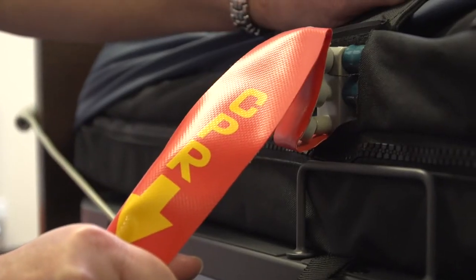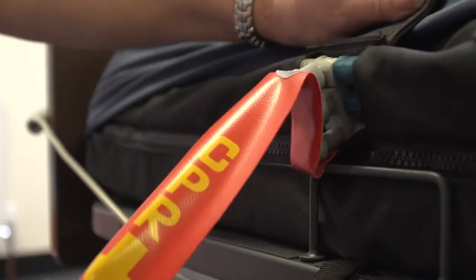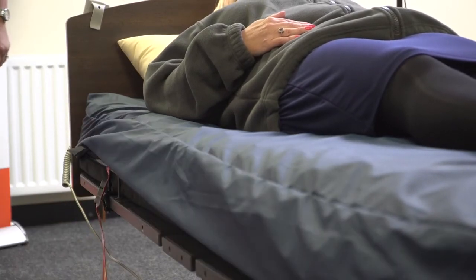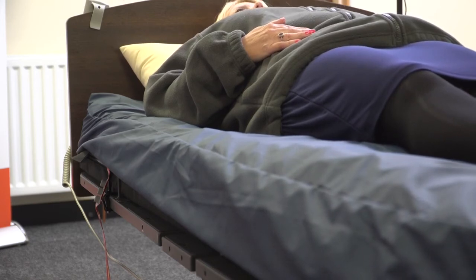The red tag labelled CPR is located behind the third cell. A swift pull is required to achieve deflation. The system will deflate rapidly in a matter of seconds. CPR can then commence.